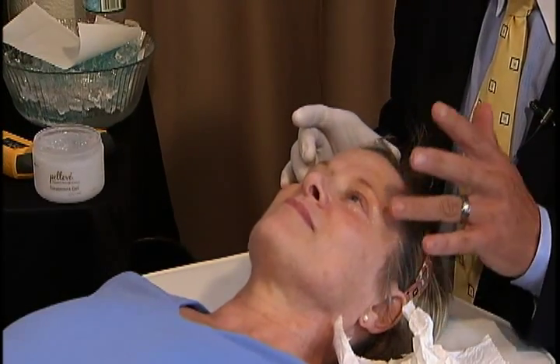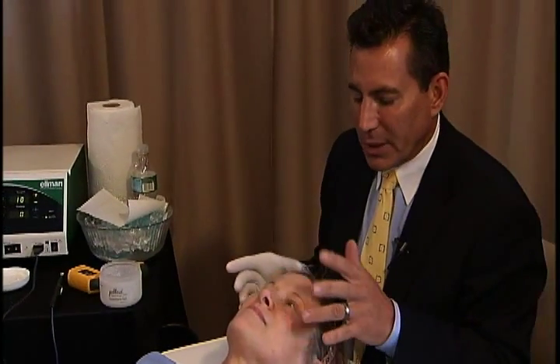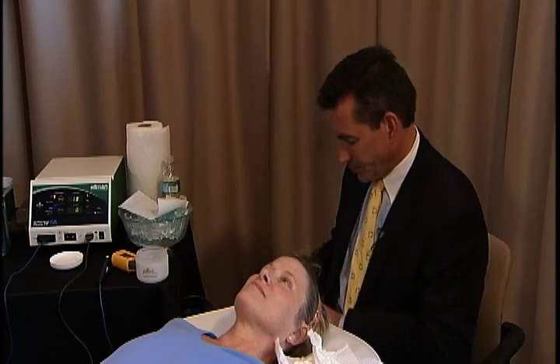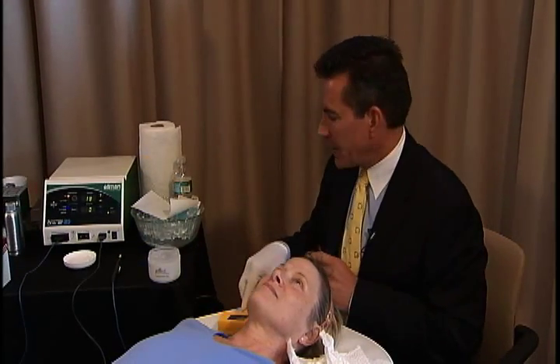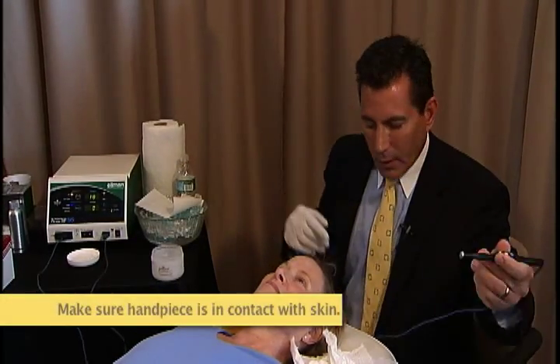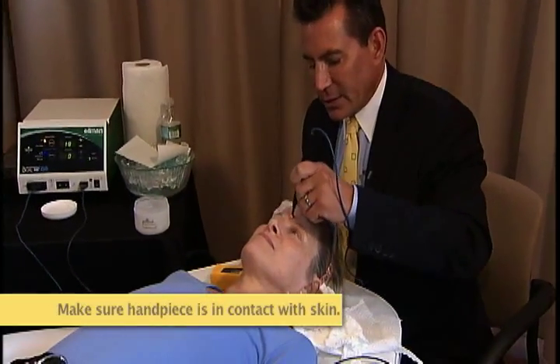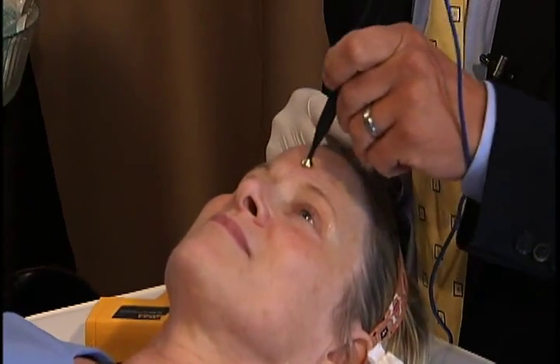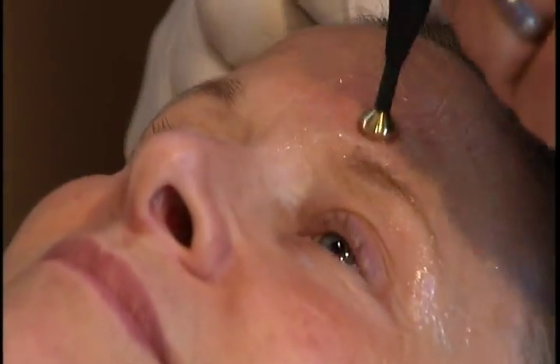So at that setting for the forehead, I'm going to treat the forehead, the lateral orbit, and the inferior orbit as well, because those are the most sensitive areas, so we use the lower setting. I'll use the handpiece. I'll make contact with the skin. Again, I like to get into the habit of using your handpiece to spread your gel, and that way you'll never activate it before you touch. And then we just activate it.